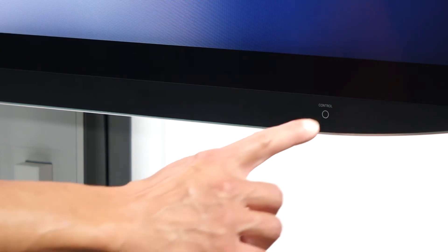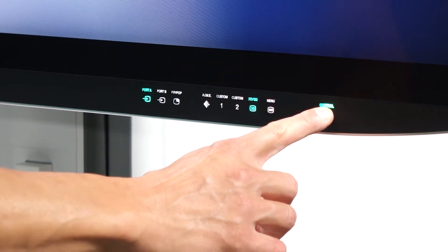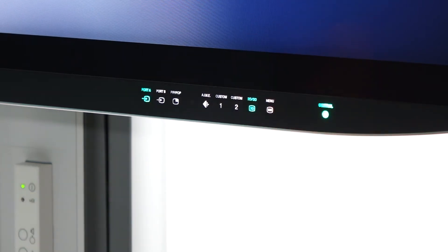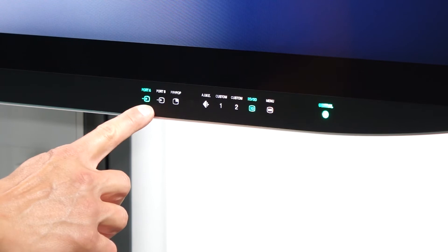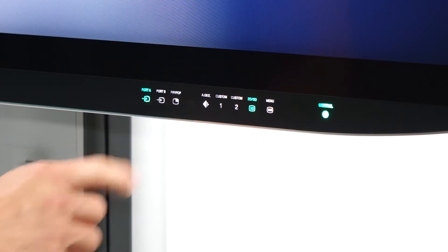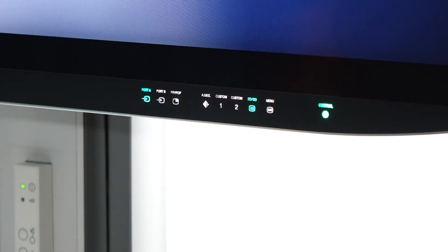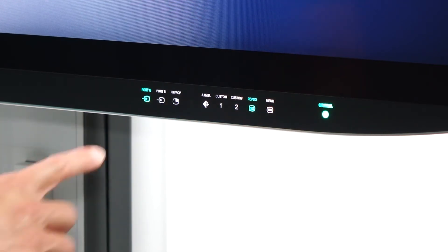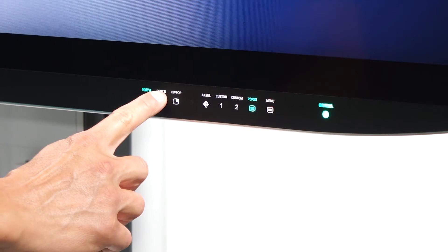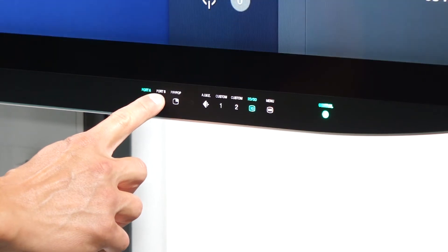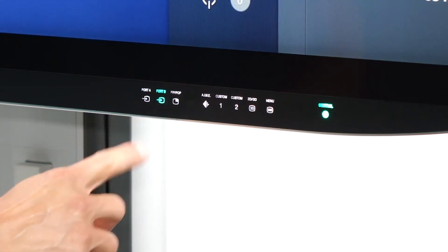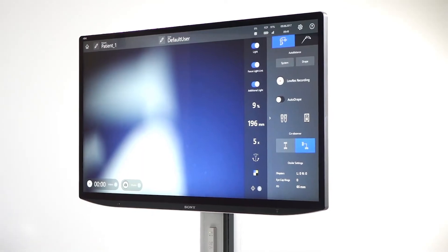Go to the menu by pressing the Control button. Select port A to display live 3D view from Zeiss Kinevo 900. Select port B to duplicate the main monitor view from Zeiss Kinevo 900.